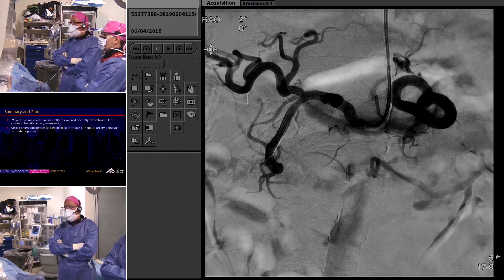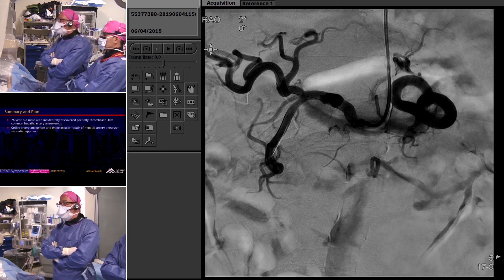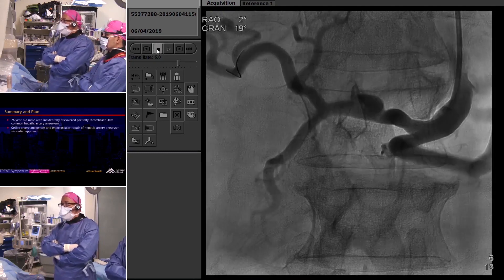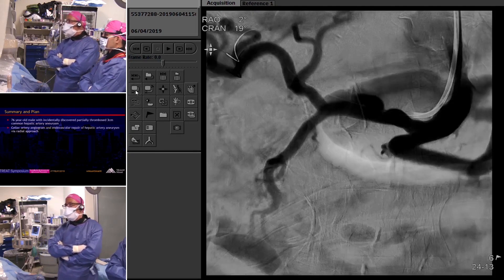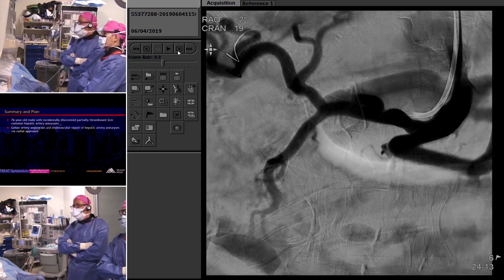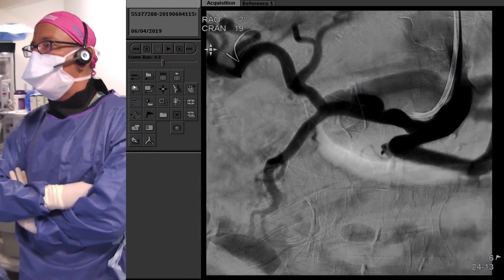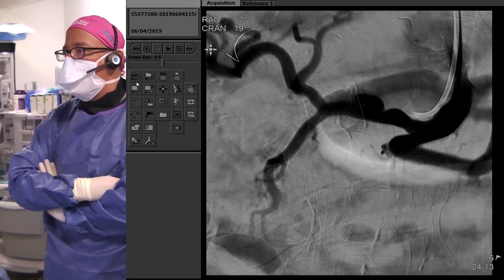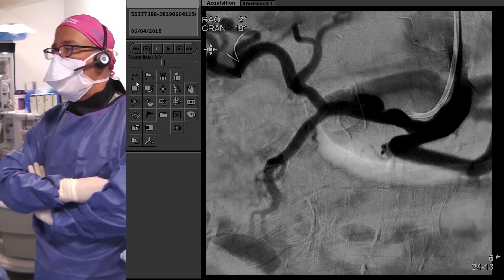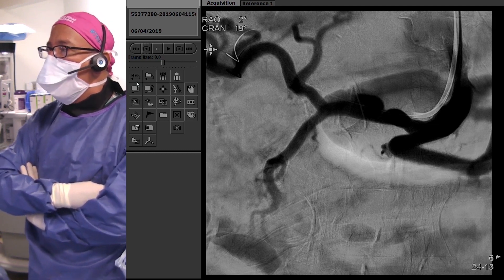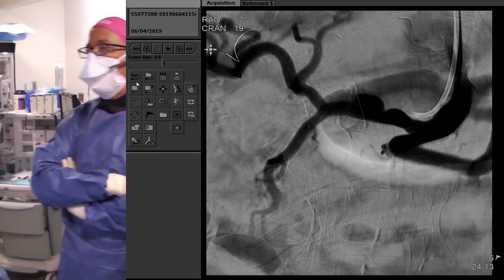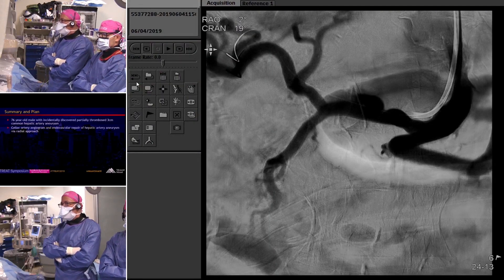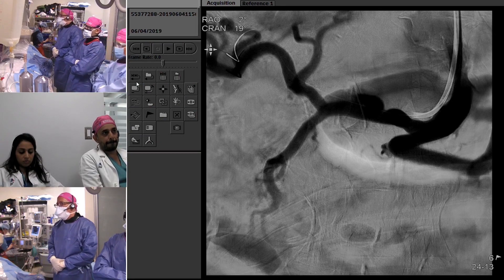On this angiogram you again see the double density in the common hepatic artery in essentially straight AP. We then created a very steep craniocaudal view, removed the buddy wire, and now have our support wire in the right hepatic artery with our guide at the ostium of the common hepatic artery. You get a sense here of this penetrating ulcer. What wasn't clearly seen on CT is that the thrombosed portion is actually three centimeters in diameter, while this area in maximum diameter is about 14 millimeters. The common hepatic measures about six and a half and the proper measures just under five.